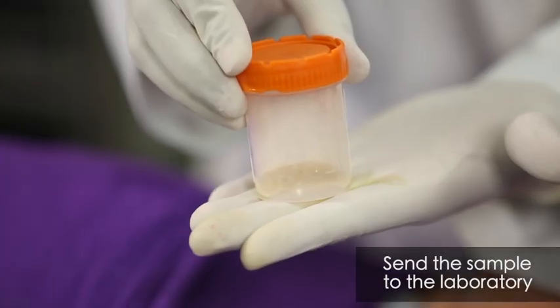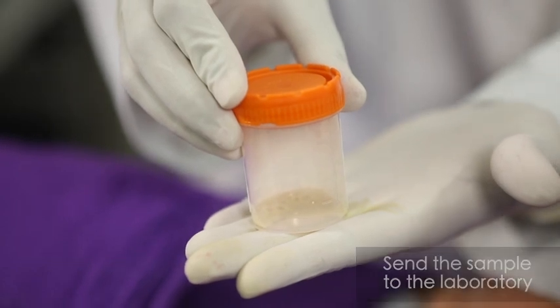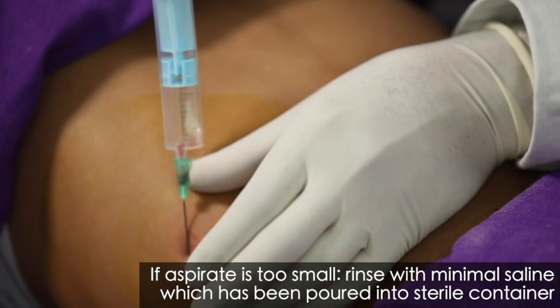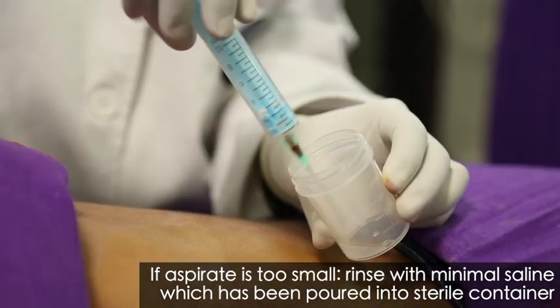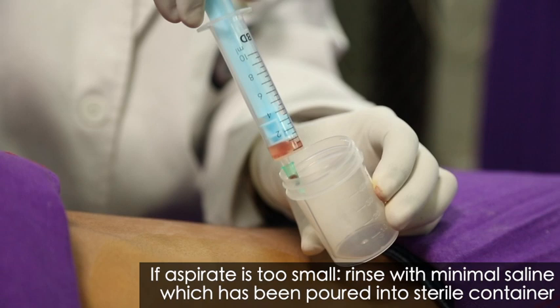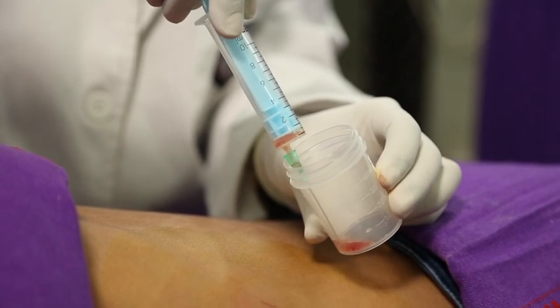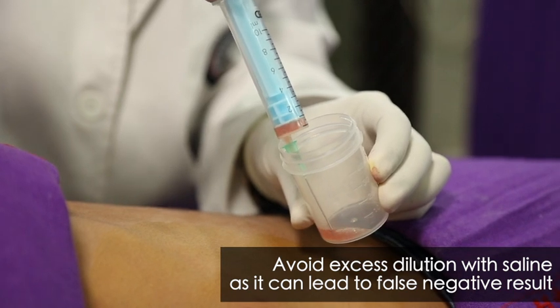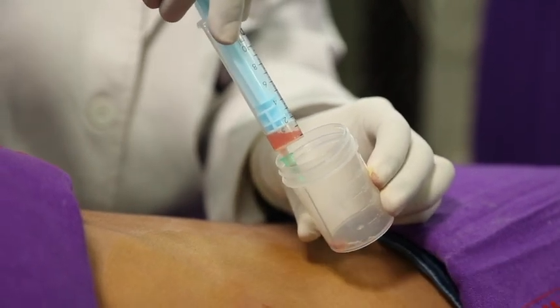Send the aspirated collection to the laboratory for further processing. If the aspirate is too small for transferring to a container, collect the material after aspirating and rinsing the syringe using minimal sterile normal saline. Avoid excess dilution with saline as it can lead to a false negative result.